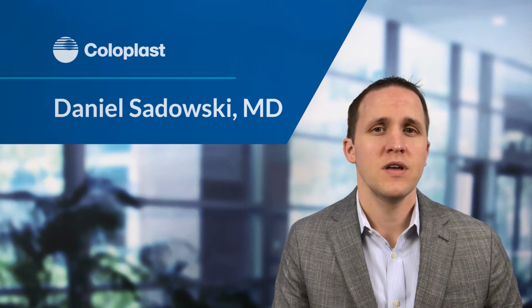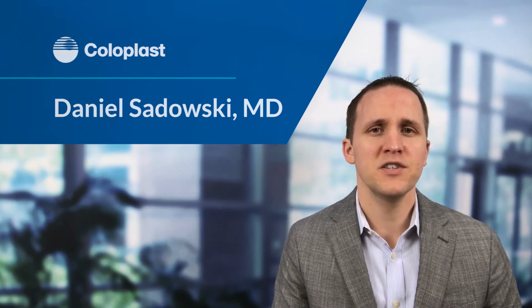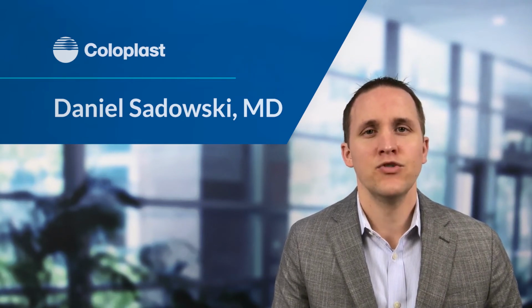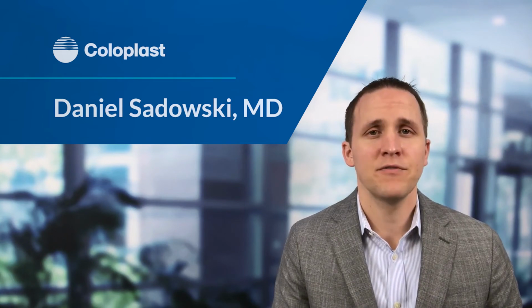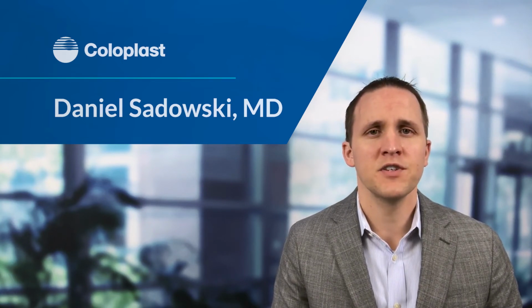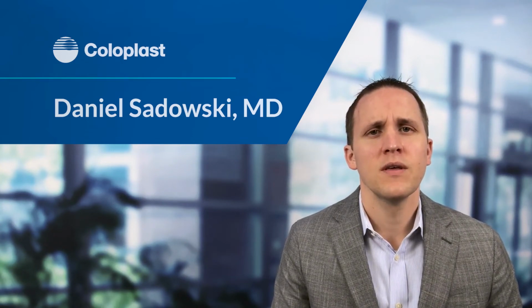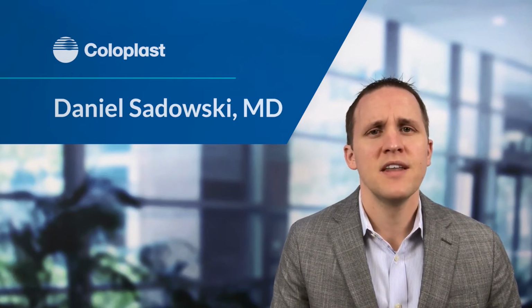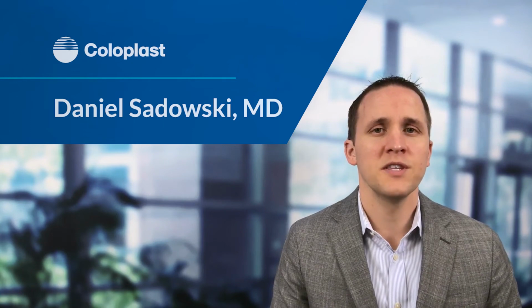After the surgery, you will typically have a dressing wrapped around the penis and scrotum, a Foley catheter draining the bladder, and a drain coming out of the scrotum. And these will be removed the day after surgery with a clinic visit to our urology clinic. Most guys will feel better after a week or two taking pain medications, and then the device is typically ready to use after approximately 6 weeks.